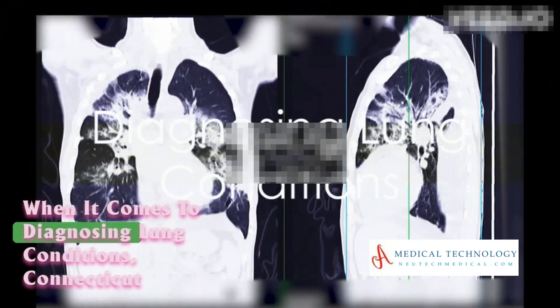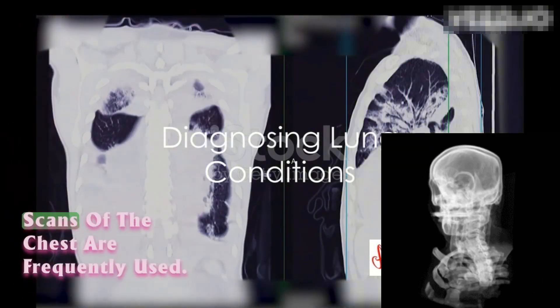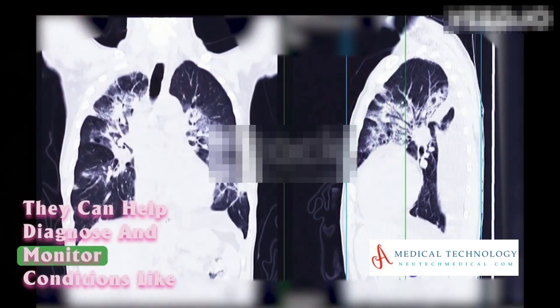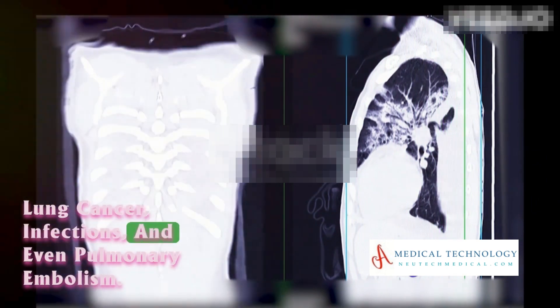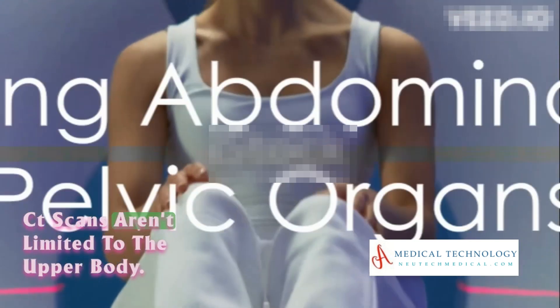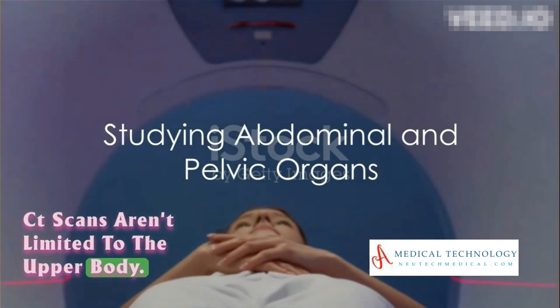When it comes to diagnosing lung conditions, CT scans of the chest are frequently used. They can help diagnose and monitor conditions like lung cancer, infections, and even pulmonary embolism.